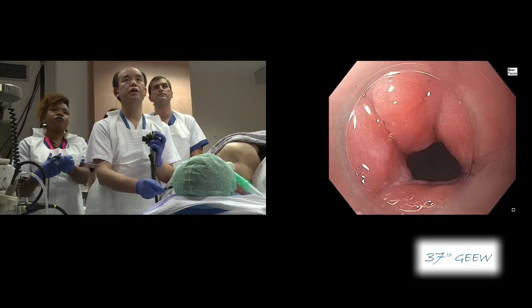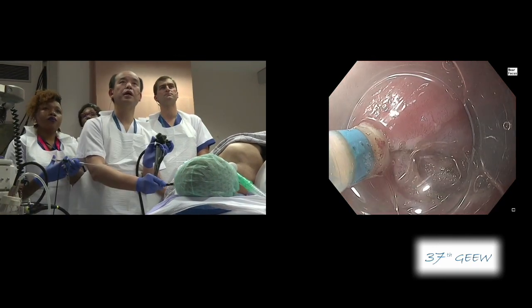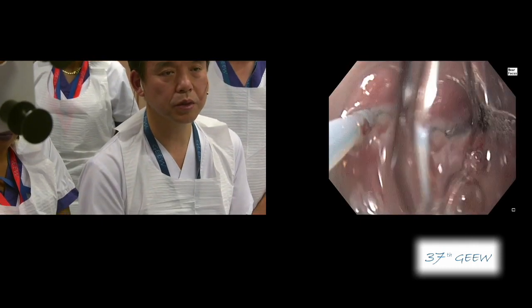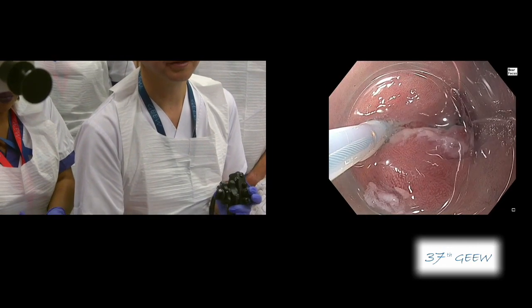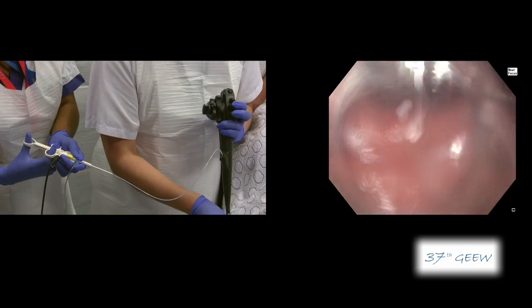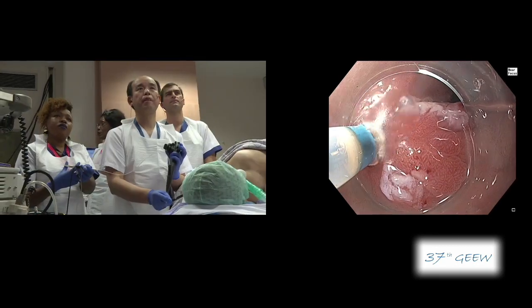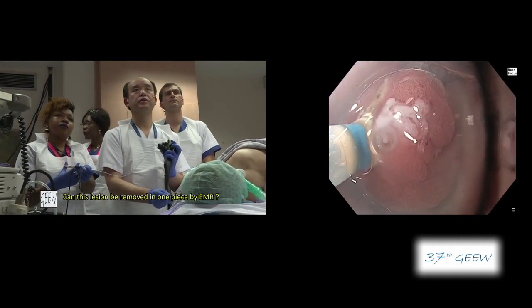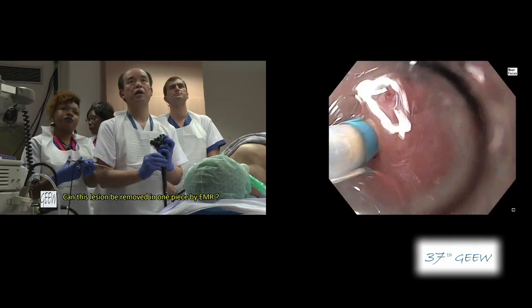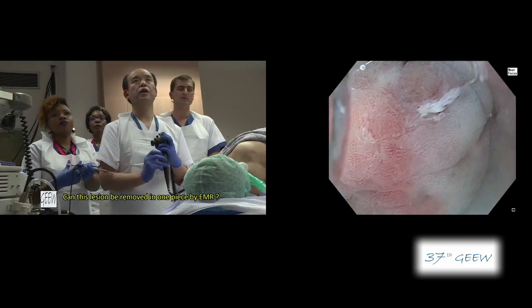Then go to the other side. Checking the edge and checking the marking dot here. Then injecting additional solution from here. Looks fine. Let's complete the mucosal incision here. And once again, give additional fluid cushion.